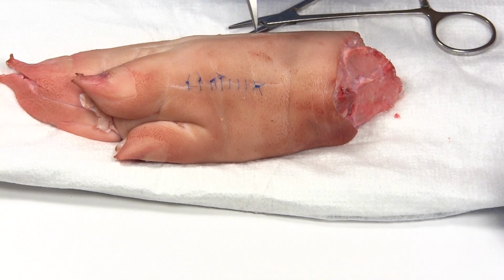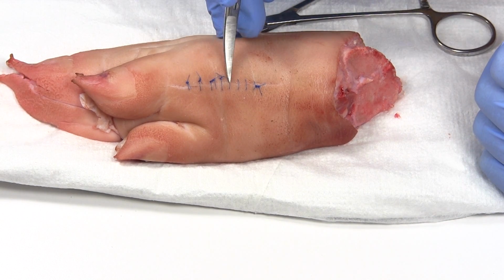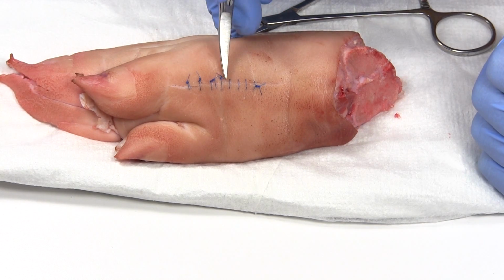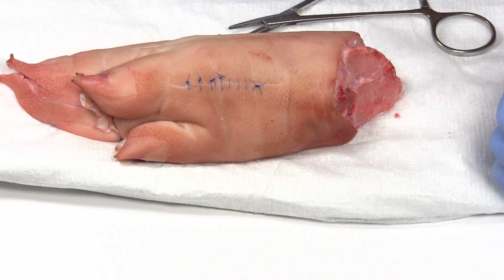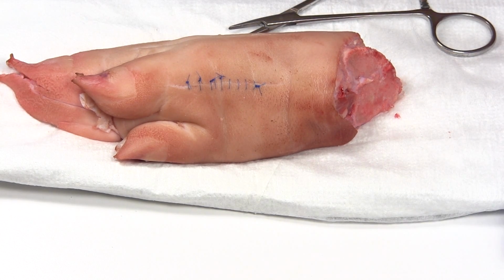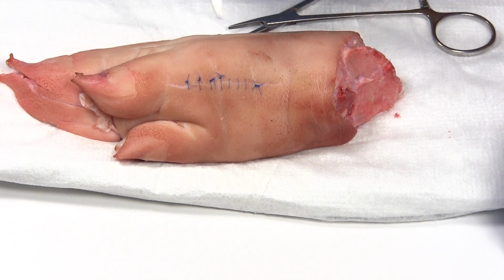And you can see that if you had several centimeters, the whole length of a running suture like this, it's going to be a lot more pretty, for what it's worth, compared to a bunch of simple interrupted knots like this, especially on a face where people are going to be staring at it. Because usually on a face, we don't cover it with a Band-Aid or anything.